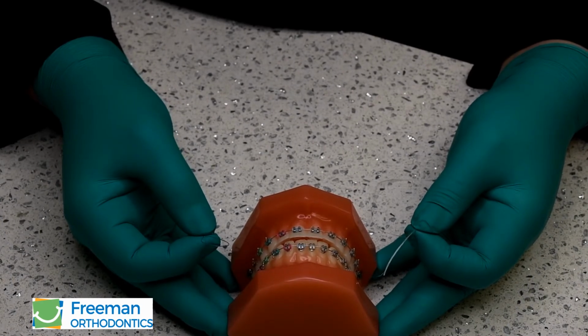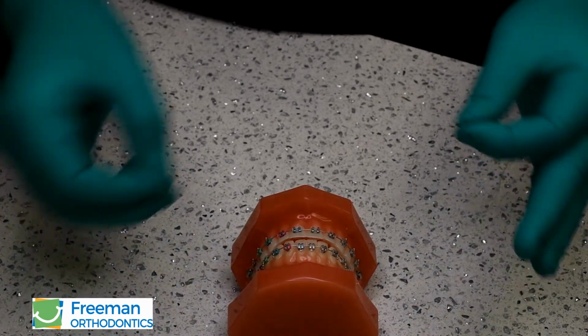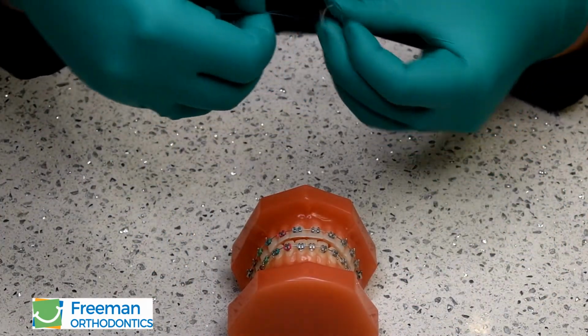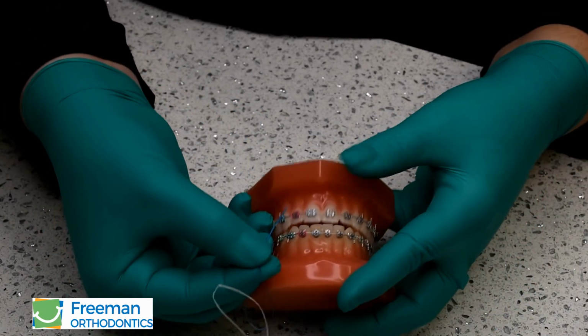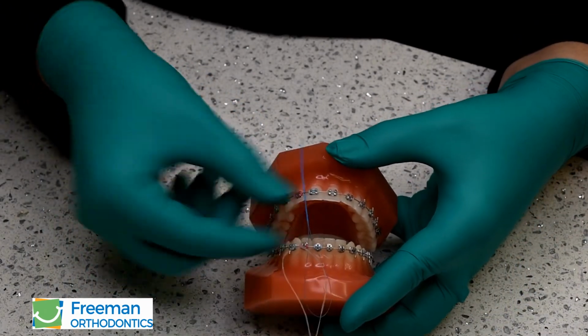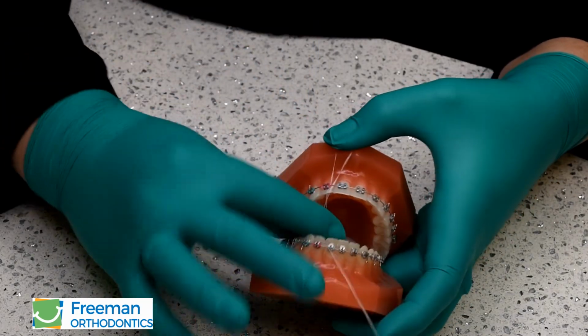Flossing may be more challenging with braces. To do this, you will need floss and floss threaders. You'll start by taking a piece of floss and feeding it through the looped end on the floss threader. The floss threader acts as a guide to easily maneuver the floss under the wire. You'll pull the floss through and floss normally.